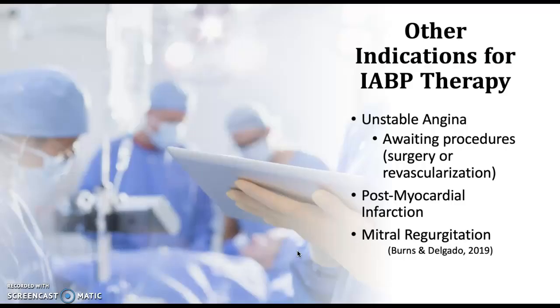So we can quickly touch on some of the other indications for balloon pump therapy. It is utilized in other situations besides cardiogenic shock sometimes. So here in the cardiac ICU, we see balloon pumps utilized in patients that have unstable angina. These patients are usually receiving maximal medical therapy, but even despite that, they are still in need of further cardiac support. So this is where the balloon pump comes in.